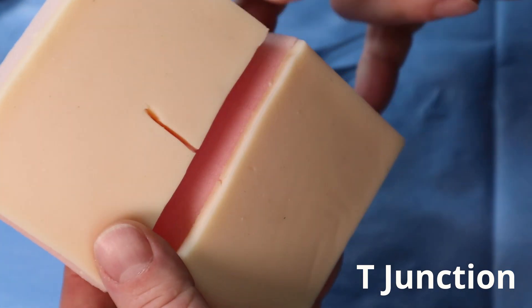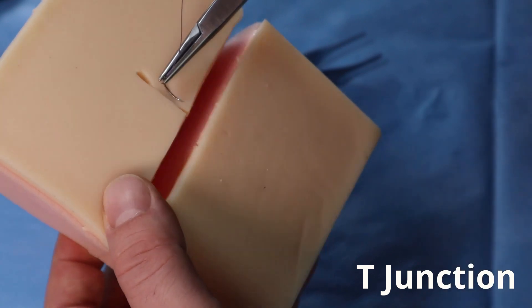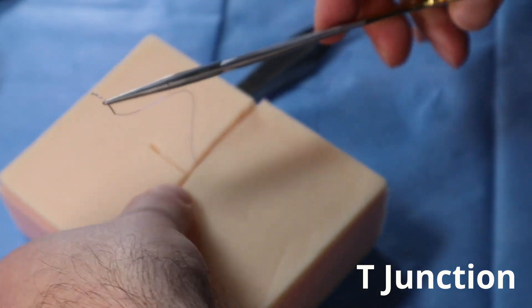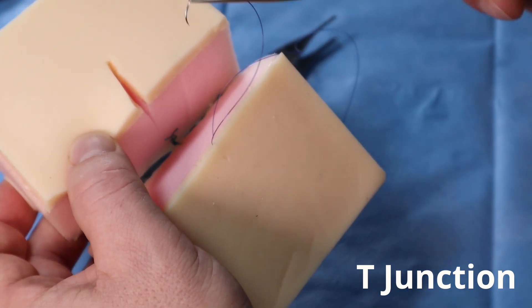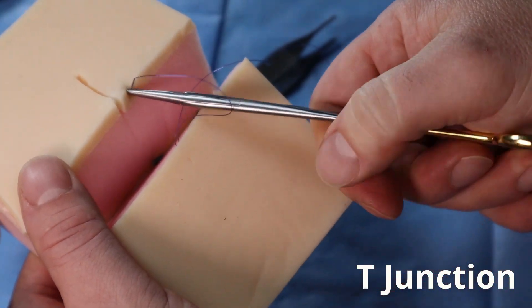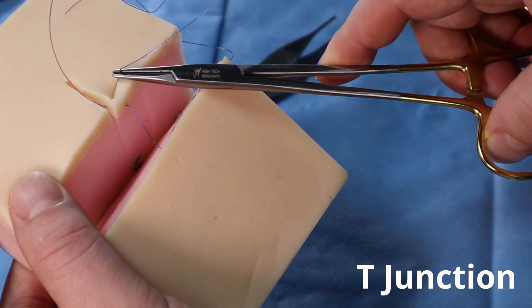So let's do a sub-Q-type suture, which means I'm going to come below the dermis. I can see my incision is right about here. I'm going to come over a little bit and insert below the dermis, come up through the dermis and out. So that was going deep to superficial. Next, I'm going to go superficial straight across from this point and stay superficial to the other side of that juncture. Now it came out superficial there.